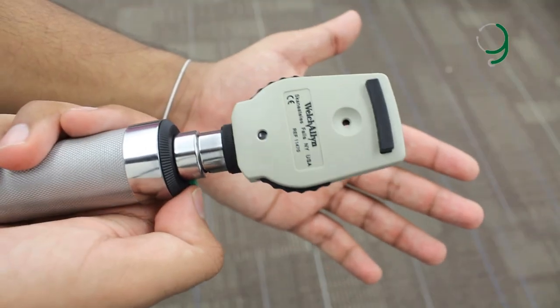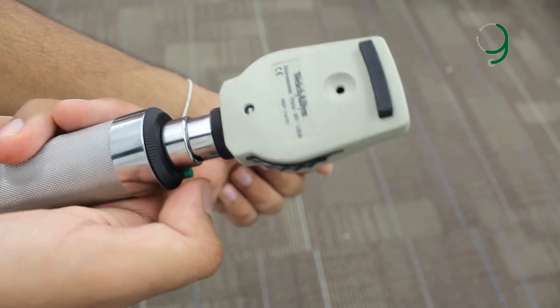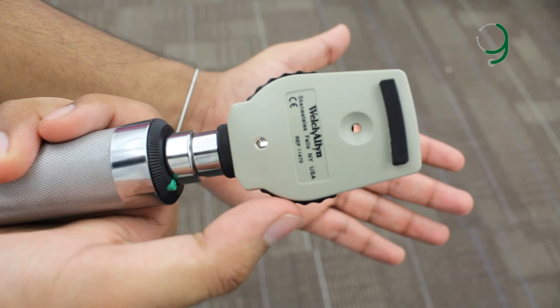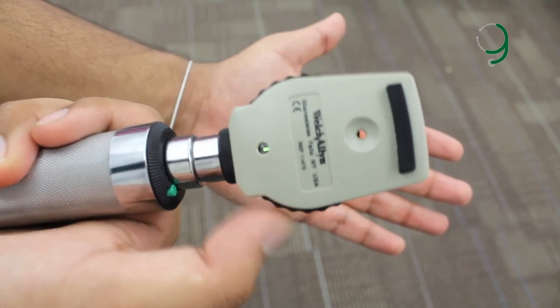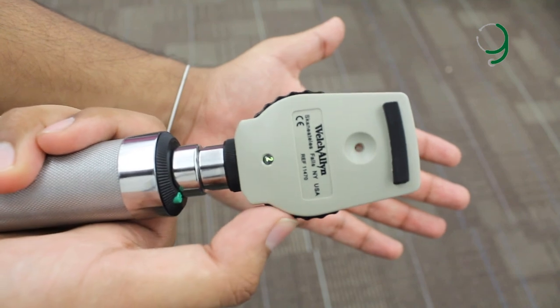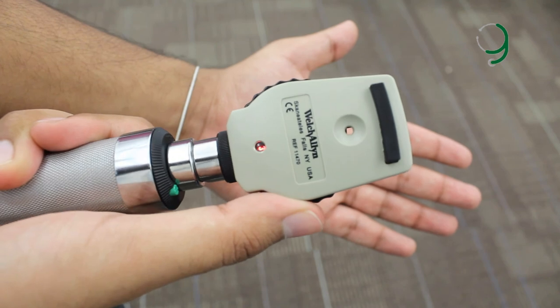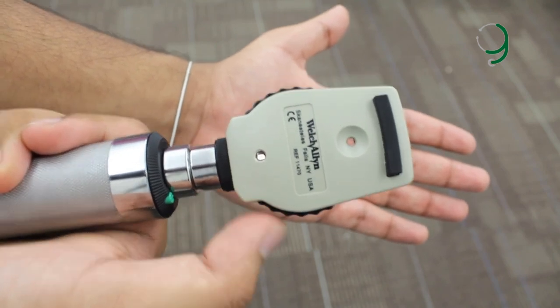This is the ophthalmoscope. To turn on the ophthalmoscope, you press the green button right here, then turn the knob counterclockwise, and it's turned on. These are to focus the lens — to change the lens focus. You can see plus one, plus two, plus three, then zero, minus one, minus two, and minus three. You need to keep it at zero for the sake of the examination.